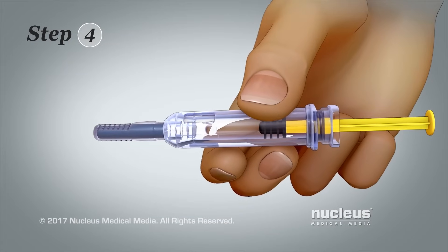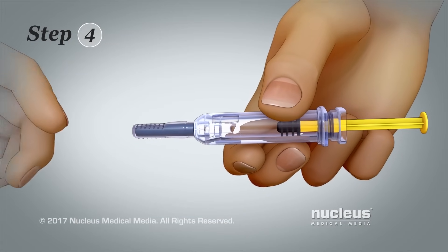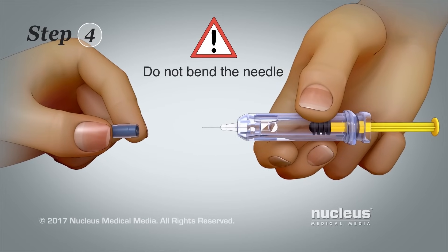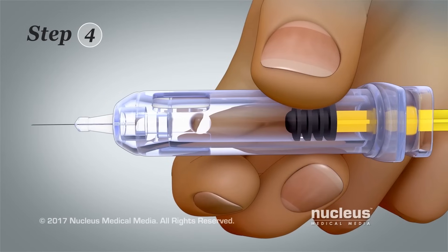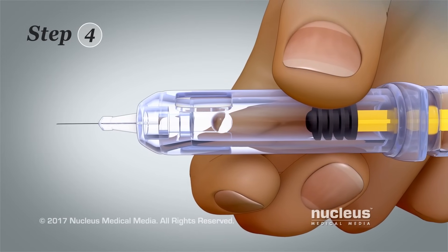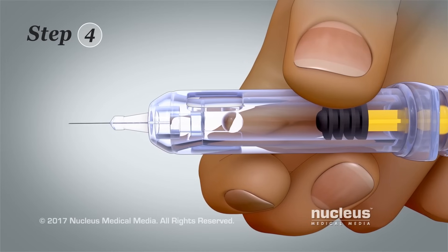Step 4. Hold the syringe sideways by the barrel. Then pull the needle cap straight off without bending the needle. There will be an air bubble in the medicine. Do not press the plunger to squirt the air bubble out of the barrel.